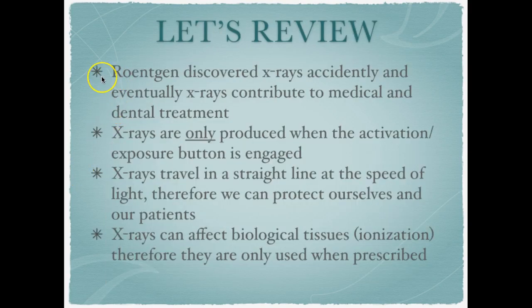So let's review. Röntgen discovered X-rays accidentally, and eventually X-rays contributed to medical and dental treatment. They are only produced when the activation exposure button is engaged, and they are produced in the X-ray tube housing, in the cathode ray tube. X-rays travel in a straight line at the speed of light.